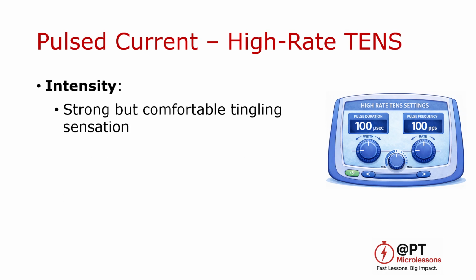Lastly, the intensity should produce a strong but comfortable tingling sensation. Because the goal is sensory stimulation, it should not produce a muscle contraction. The higher frequency helps maintain that sensory response. It is also important to remember that intensity varies between patients, and even from session to session, so it should always be adjusted based on patient feedback.